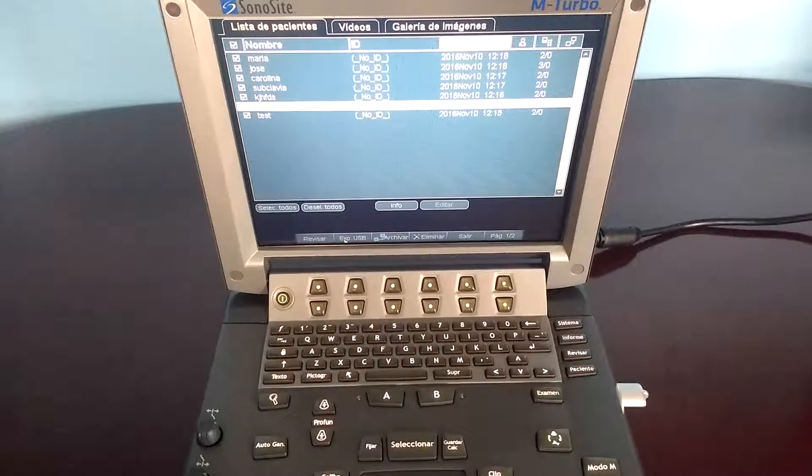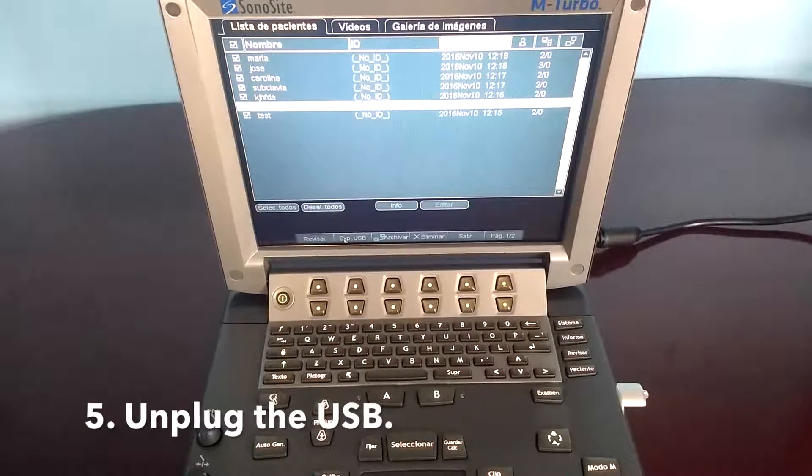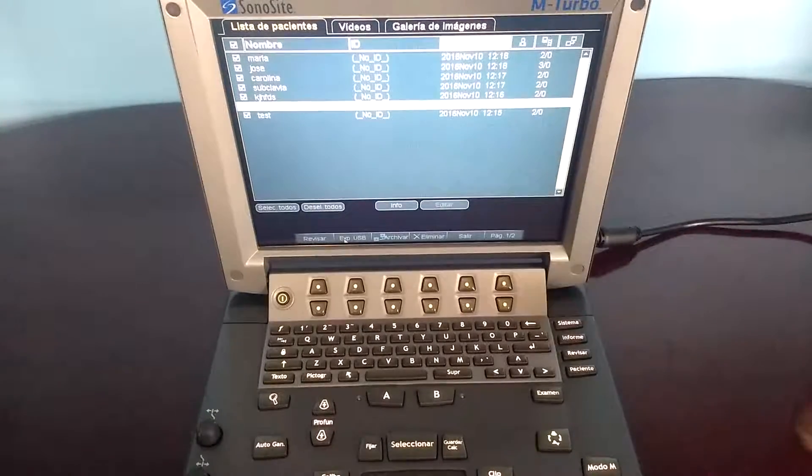When the USB icon stops blinking, the exportation has finished and you can now unplug the USB memory stick.